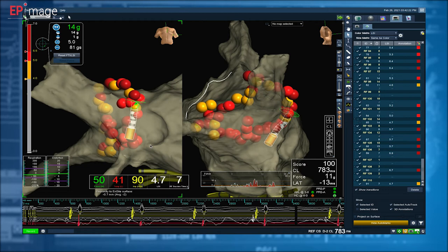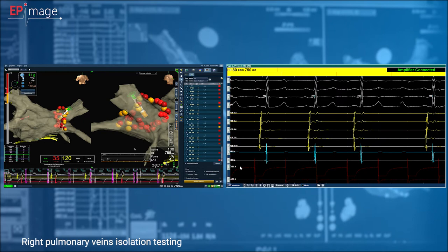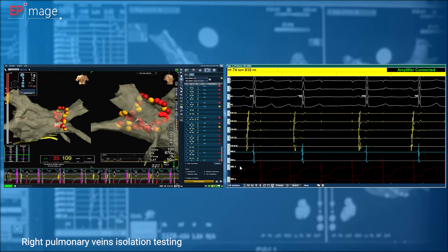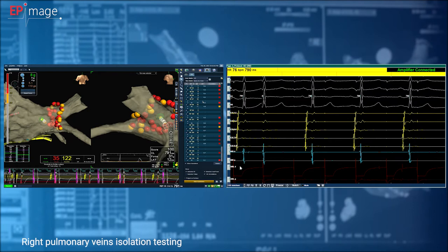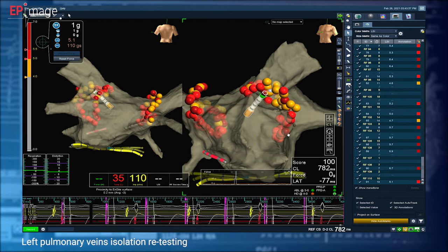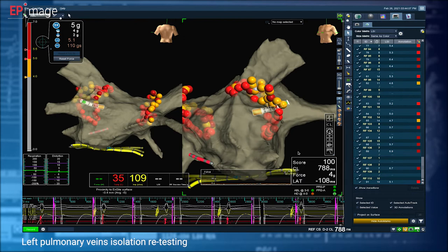So now we are doing just final touches around the line, and we'll be checking for isolation of right pulmonary veins. So again, I'm pacing from the tip of the ablation catheter, still keeping an eye on good contact with the tissue. As you can see, both veins are effectively isolated, so we don't need to perform an additional line in the carina before removing the catheter from the left atrium. I always check again for the isolation of left pulmonary veins, and as you can see, they are isolated, so there is no need for extra application.